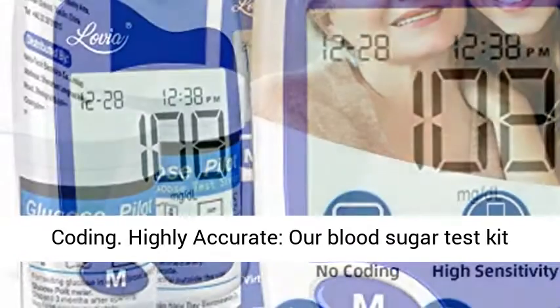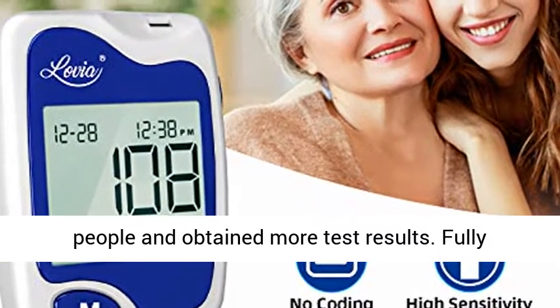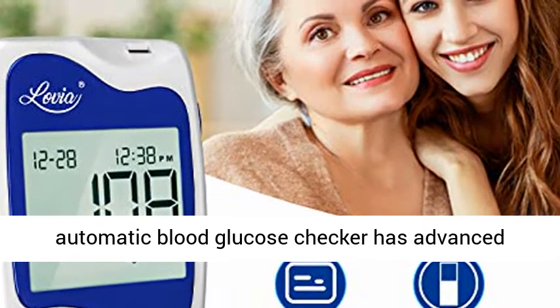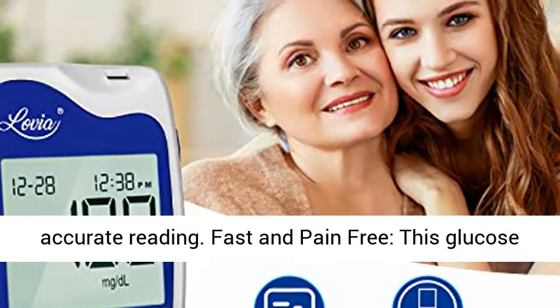Highly accurate: our blood sugar test kit has conducted research on blood glucose with many people and obtained extensive test results. The fully automatic blood glucose checker uses advanced measuring techniques to provide the most accurate reading.